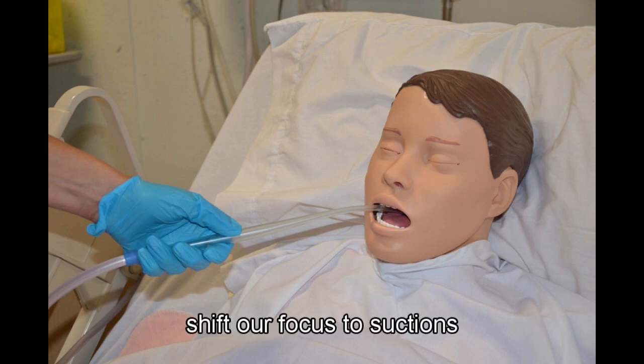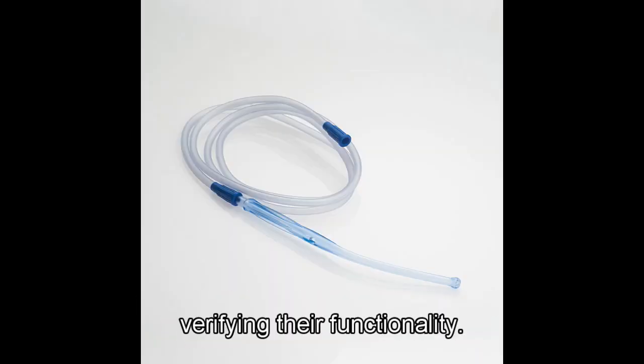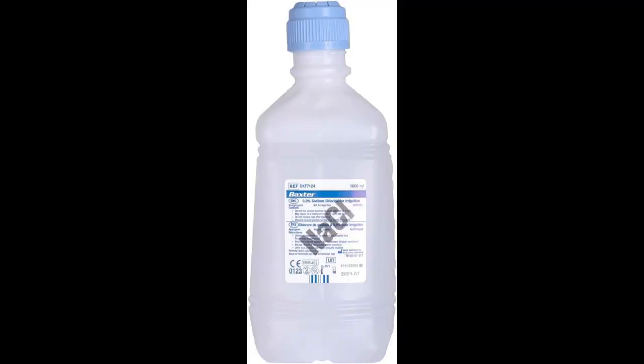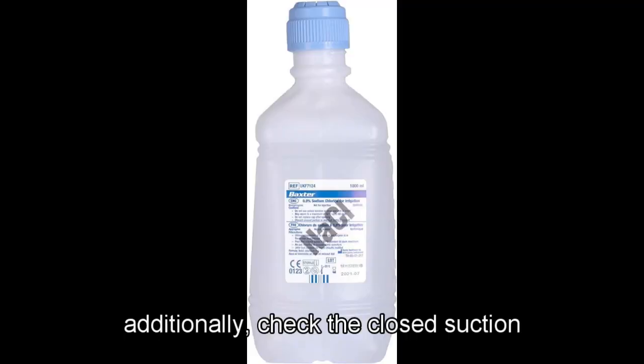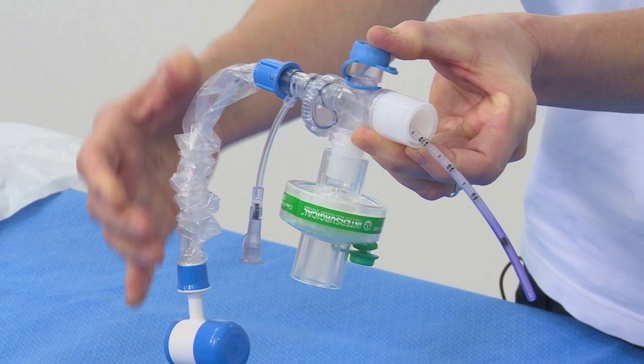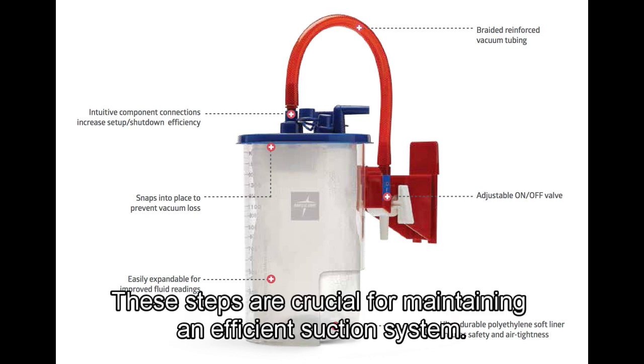Now, let's shift our focus to suctions. It's imperative to ensure an ample supply of Yankauer suctions, verifying their functionality. Keep spares available for maintenance. Additionally, check the closed suctions. They should be up to date and operational. Confirm that suction dishes are clean and not filled. These steps are crucial for maintaining an efficient suction system.